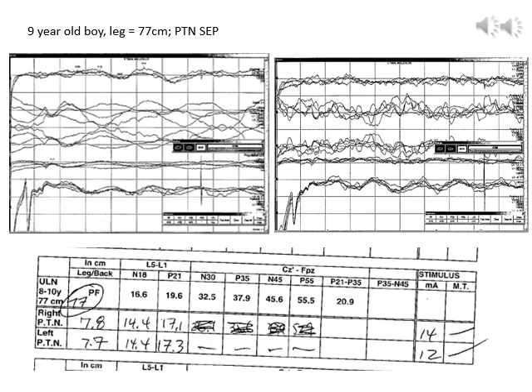And so we can't dissociate those two things, but it's an abnormal study, either due to a nerve root dysfunction at lumbar spine or a central conduction problem between lumbar spine to cervical spine.